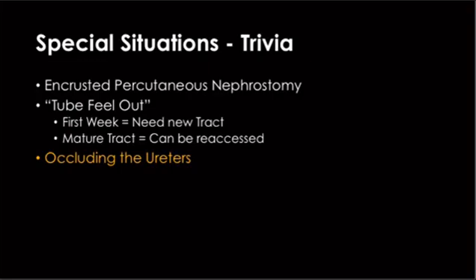So there's a whole bunch of different methods for doing this. Antegrade placement of coils, gelfoam, tissue adhesive, detachable balloons. A lot of places you will see people talk about placing larger coils at the proximal and distal ends of the nest to help avoid migration of the smaller coils.